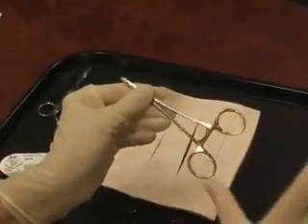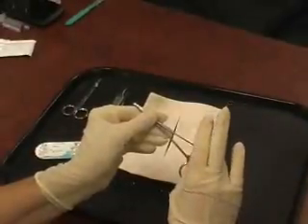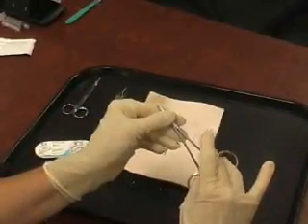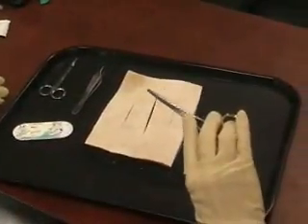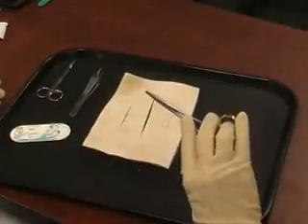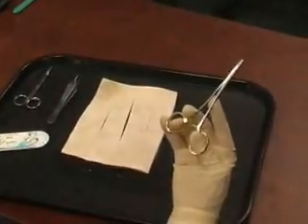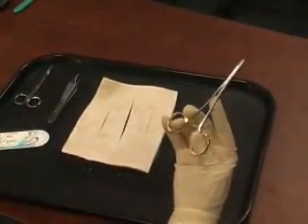And so basically you're going to start by placing your thumb and your fourth digit into the rings. Put the third digit sort of right in this little crook, and then the index finger right on top. The little finger can just sort of hold over here on the ring, and basically this is called the tripod grip. This is what you're going to use for not only the needle driver but scissor technique or cutting technique.